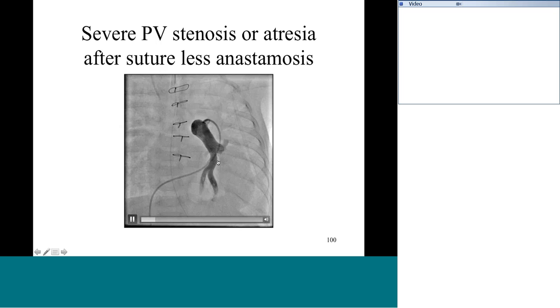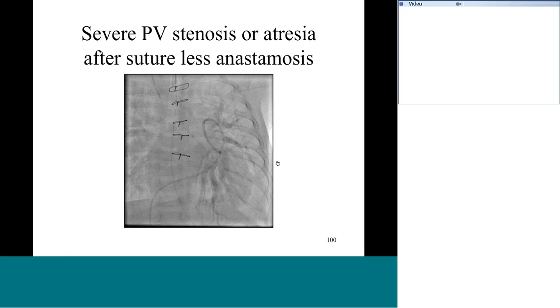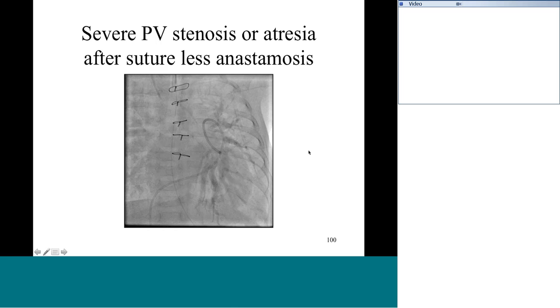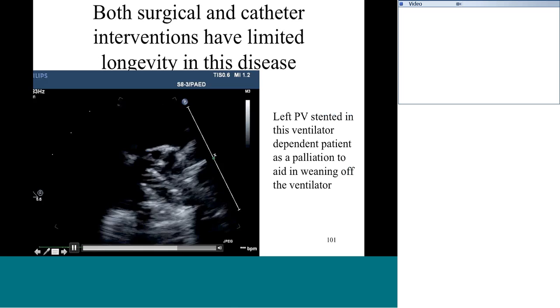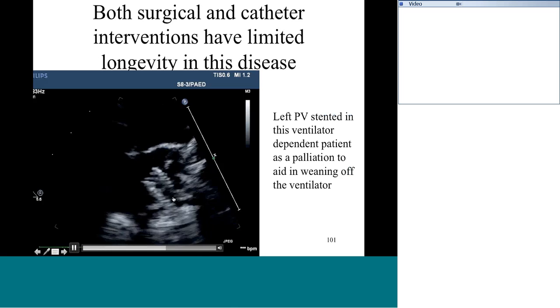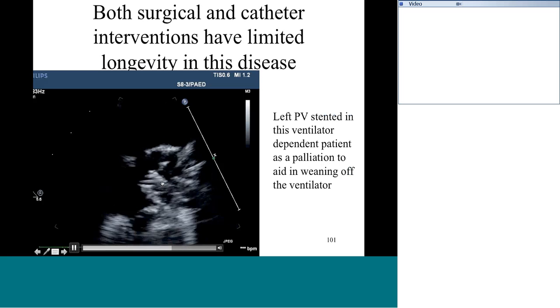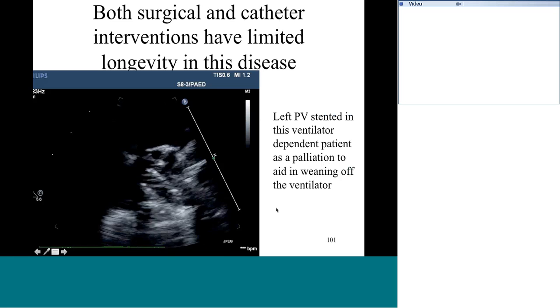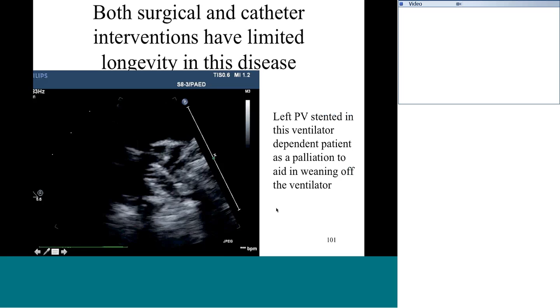So that means even though it is sutureless anastomosis, you can see that the dye is just staying in the left pulmonary artery. That means this is uniformly a bad disease. You see the patient is still intubated, there is a Ryle's tube, there is a neckline. I mean, basically, this pulmonary venous treatment is very bad. This is an alternative method, stenting of the left pulmonary. Everything is bad. Actually, this treatment of pulmonary vein stenosis itself is known to have very poor results.